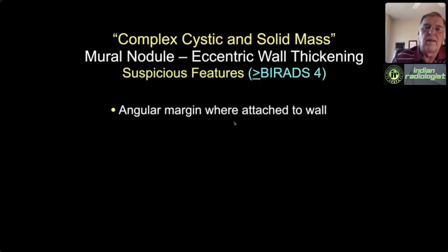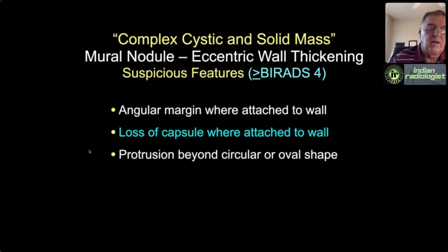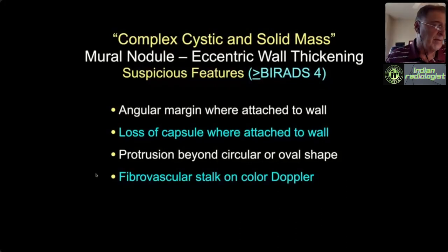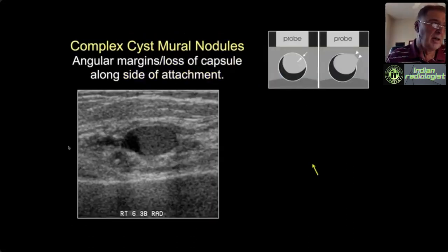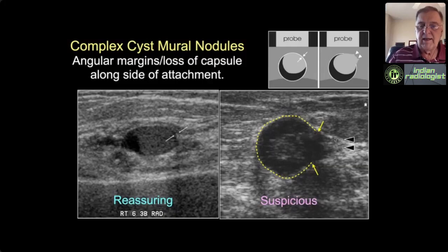At the point of attachment we don't want to see angles, loss of capsule, protrusion into ducts creating a keyhole shape, or internal vascularity. Apocrine metaplasia virtually never incites neovascularity. On the left, a reassuring complex cystic and solid mass caused by apocrine metaplasia filling about 80% of the cyst—oval shaped with an intact thin echogenic capsule all along the point of attachment. On the right, a hemorrhagic papilloma with absent capsule along the attachment point and extension into ducts creating angles and irregularity. So left is reassuring, right is suspicious.